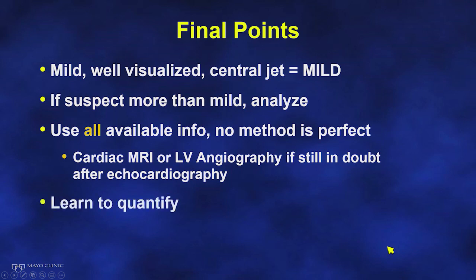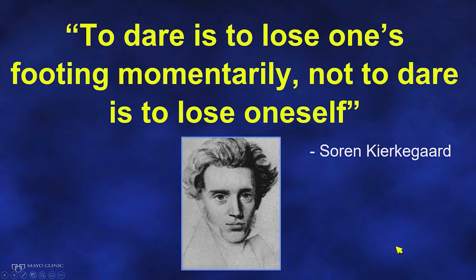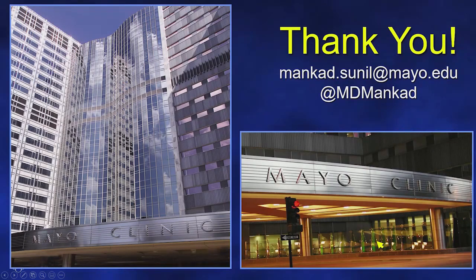Learn to quantify. It's a responsibility we have to our patients and colleagues to produce a report closest to the truth. And I like this quote from Soren Kierkegaard: "To dare is to lose one's footing momentarily. Not to dare is to lose oneself." I've also included in your syllabus from the 2020 ACC/AHA guidelines, first authored by Dr. Catherine Otto, the indications for intervention in both functional and degenerative mitral regurgitation, primary or secondary mitral regurgitation, primary being degenerative.